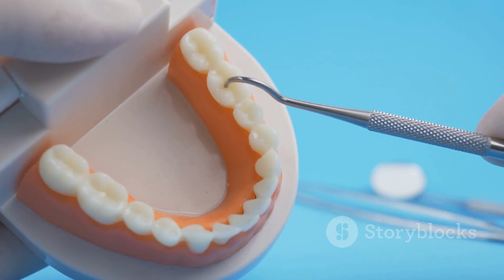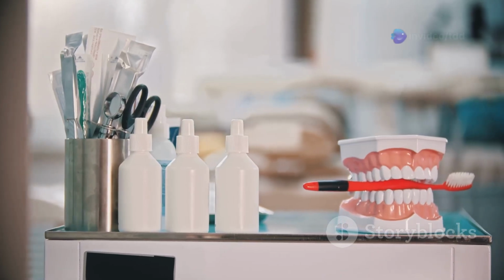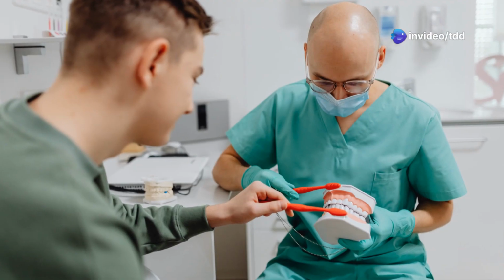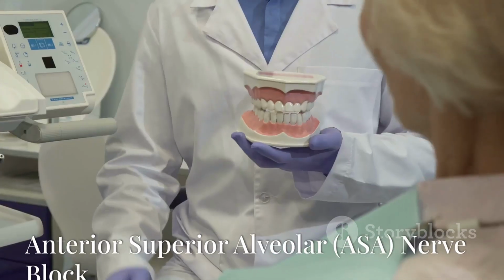The middle superior alveolar, or MSA nerve block, targets the maxillary premolars and the mesiobuccal root of the first molar when present. The injection site is above the apex of the second premolar. The landmark here is the mucobuccal fold over the premolar.